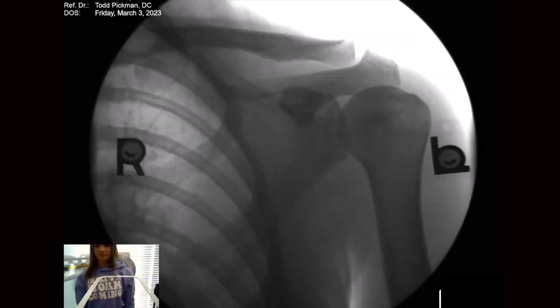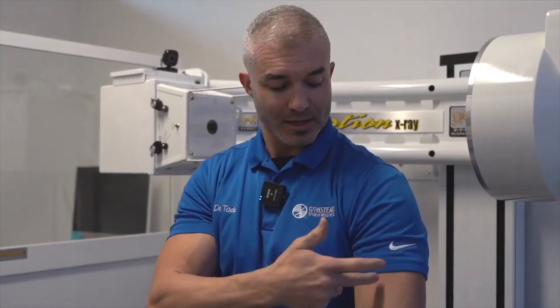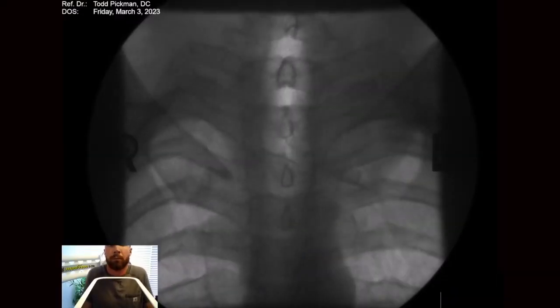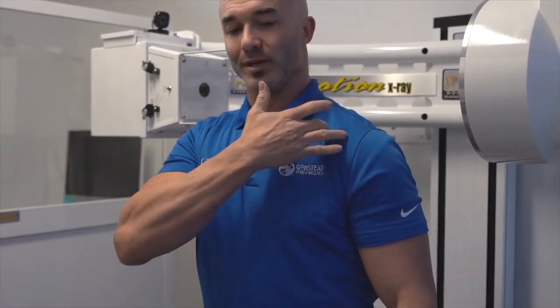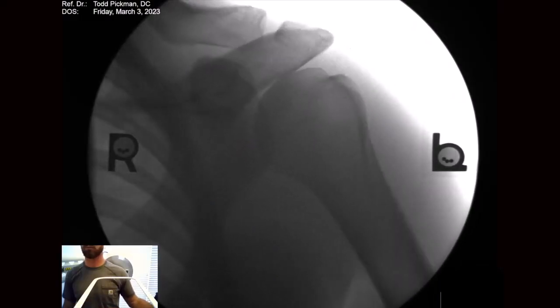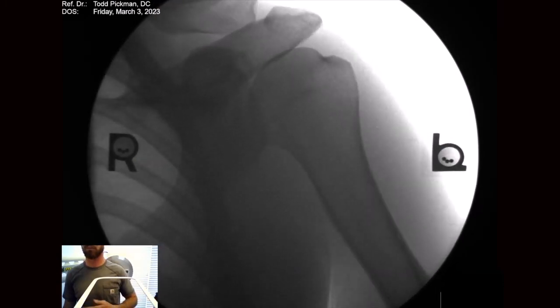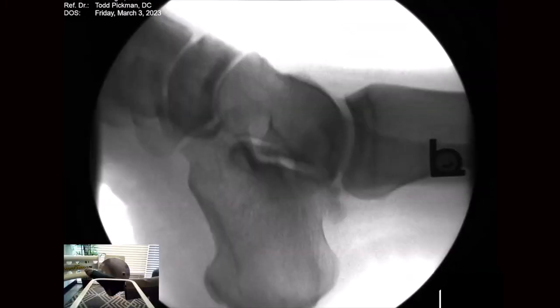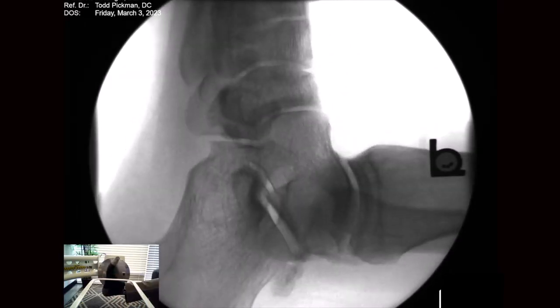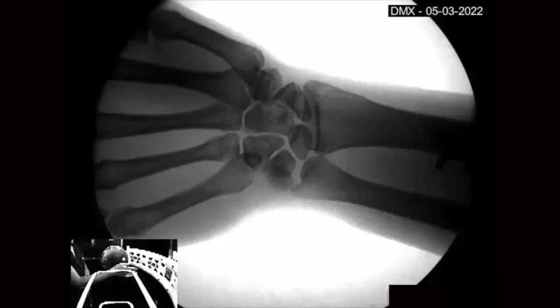It's pretty amazing. The shoulder girdle, so this shoulder joint, which is the glenohumeral joint. Then you have the AC joint, the sternoclavicular joint. So this whole joint in between, the collarbone, the scapular movement, the shoulder blade movement. That's something that can be visualized in detail. We can look at things in the knee precisely. We can look at things in the ankle, in the foot. We can also look at stuff in the wrist, fingers, and elbow. So all in all, pretty much everything can be visualized.